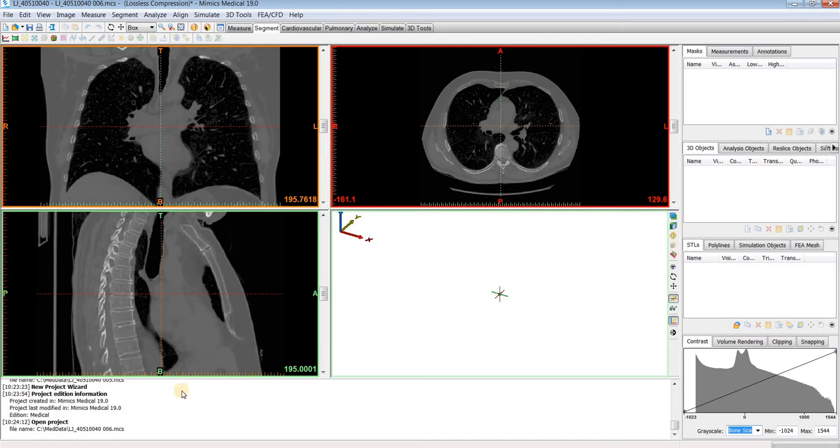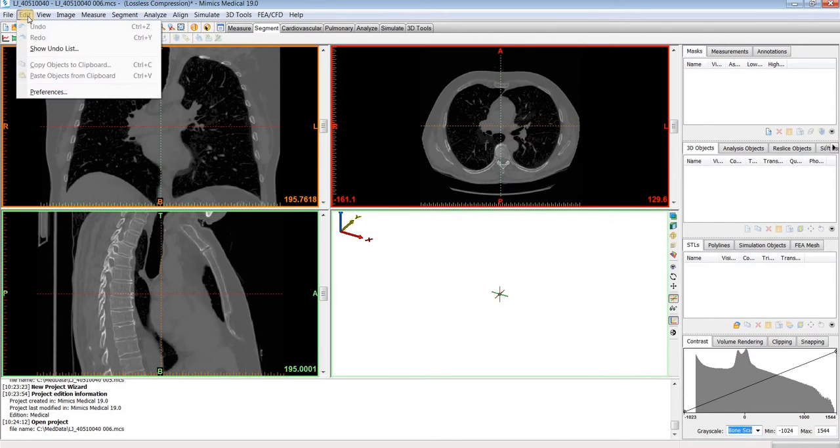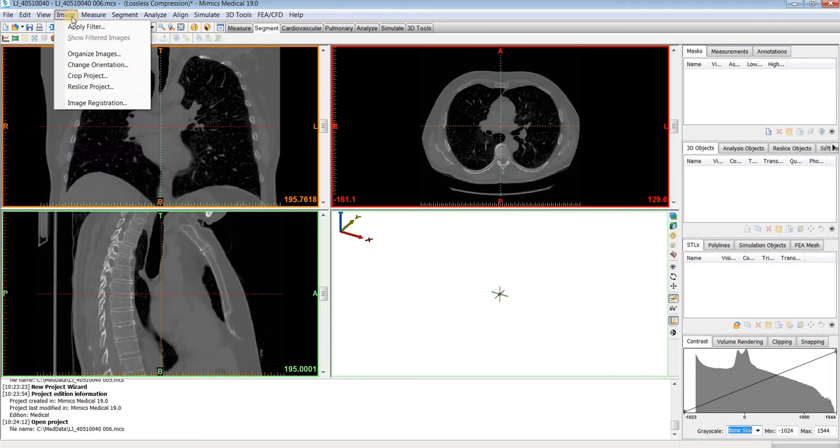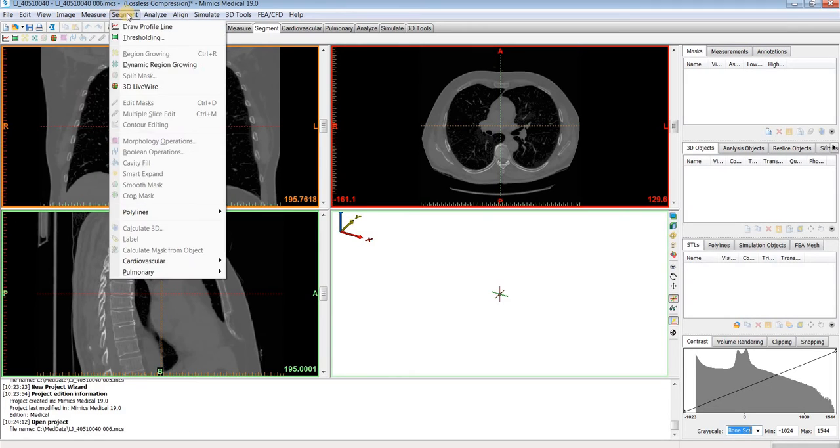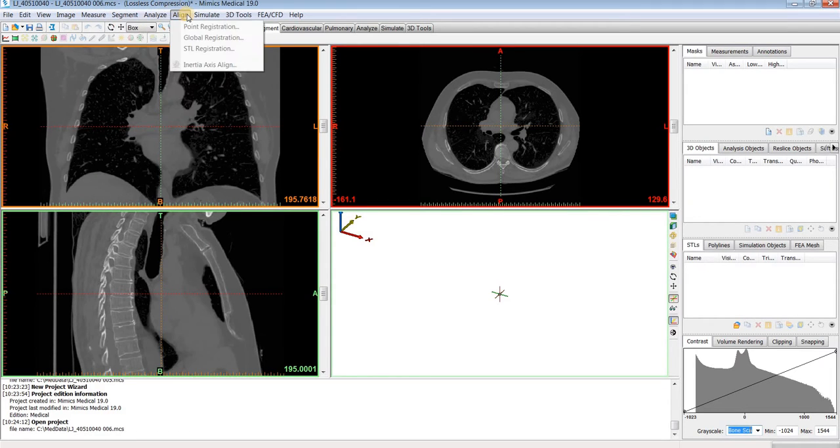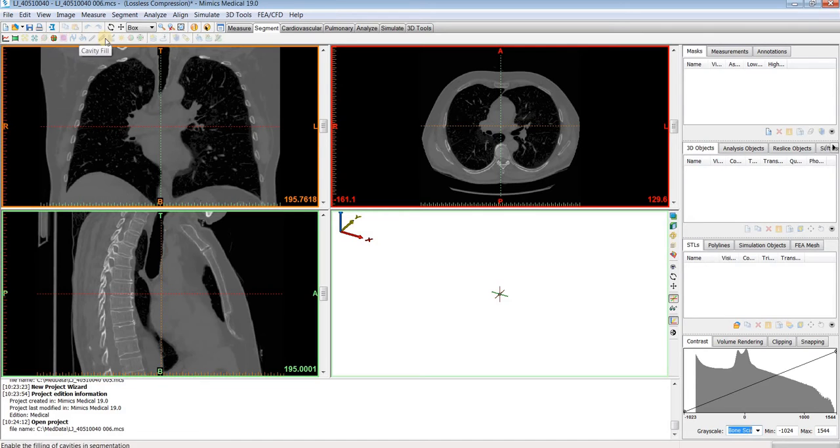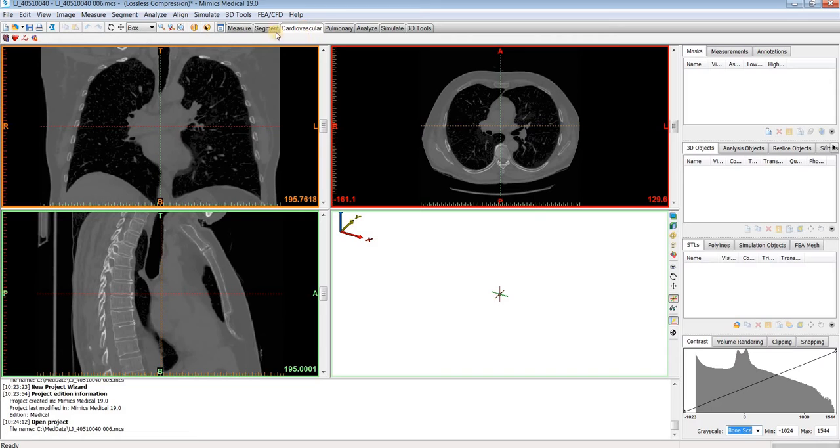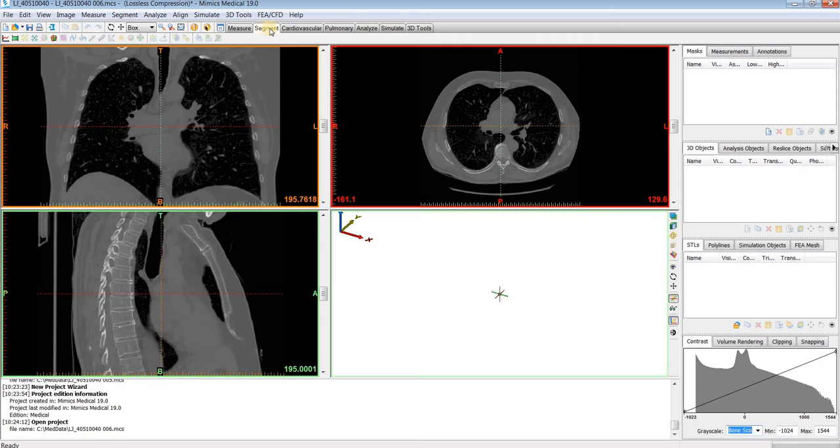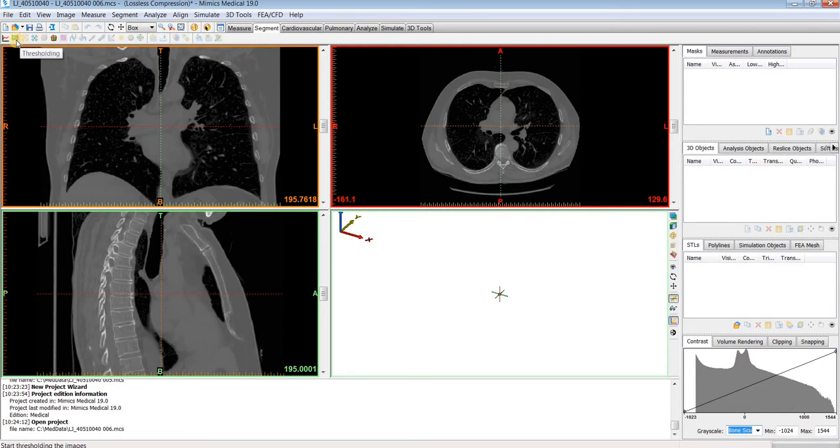Up at the top here we have our main menu dropdowns, which will contain all the tools within the software. Below that is shortcut keys corresponding to which menu tab you have selected here. Most of the time, I just keep it on the segment tab because those are typically the most commonly used tools that I do.